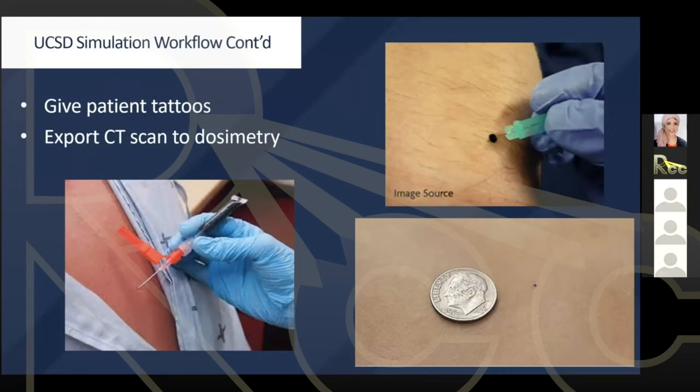Yes, sure. Go on. I want to ask a question about tattooing during simulation. It will be a little bit painful. I think the tattoo is different. When you treat, you have to shift to a different point, so again tattooing, this will be two different points.